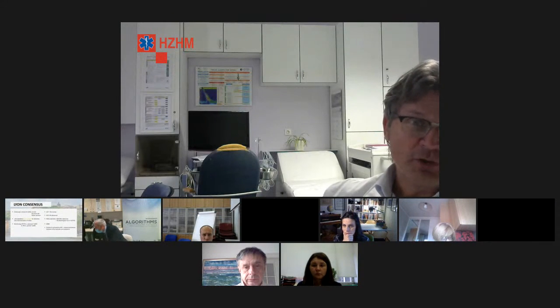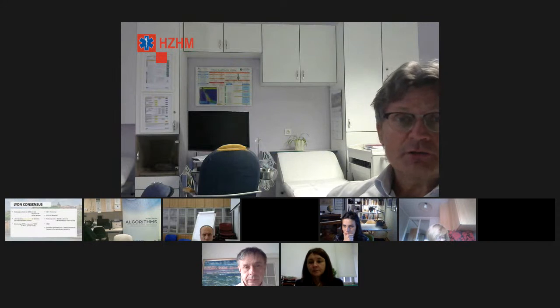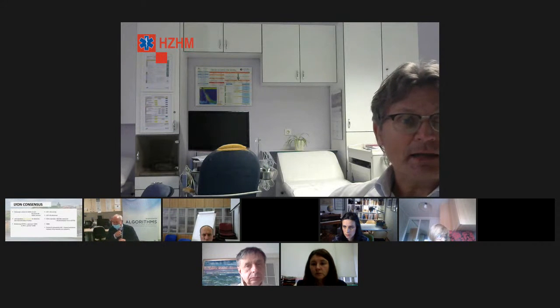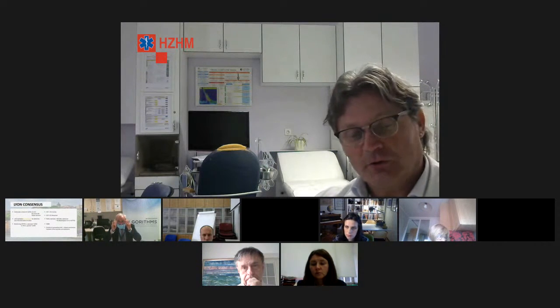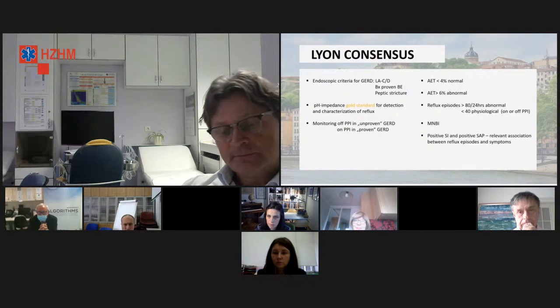Što mi to jako lijepo opišemo kad je gore zrak otišao, kad je tekućina, ali što nam je zapravo krajnji cilj, kako to utječe na našu terapijsku odluku. Za sada mi zapravo koristimo ove pH jednokanalne katetere sa impedancom, čisto iz tih financijskih razloga, jer teško dolazimo do sredstava novaca, mada svi podržavaju nas, ali kad treba izdvojiti za katetere, onda to teško ide. Tako da to je ta priča u tom smislu. Da, evo sad je, hvala vam.